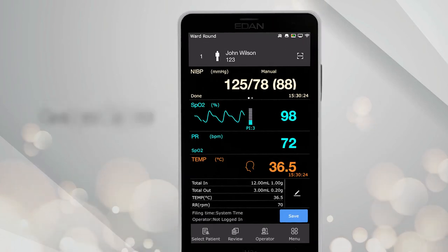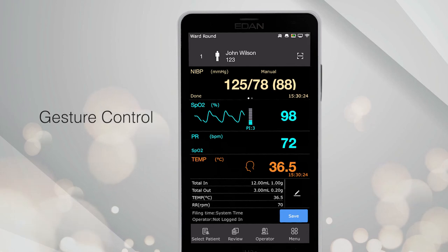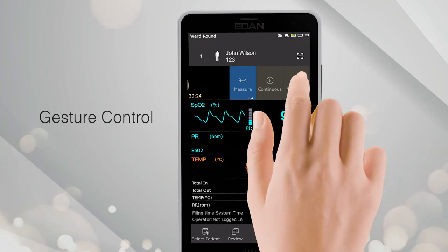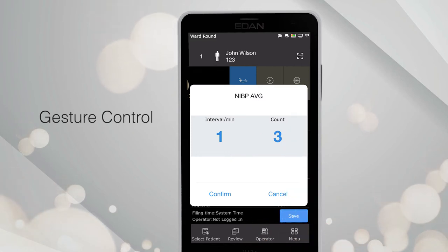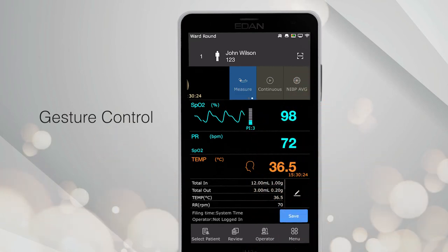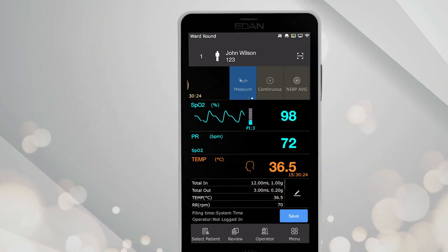With its capacitive touchscreen, gesture control is supported, such as swipe operation. You may easily switch between different NIBP functions, such as the AVG mode for automatic average measurements. Just like any touchscreen-enabled device, the user interface of the IM3S will intuitively respond to user input.